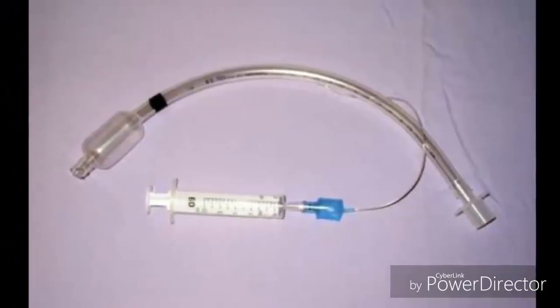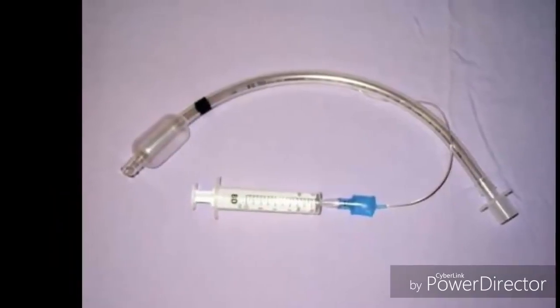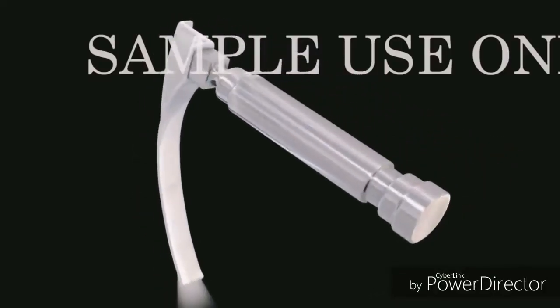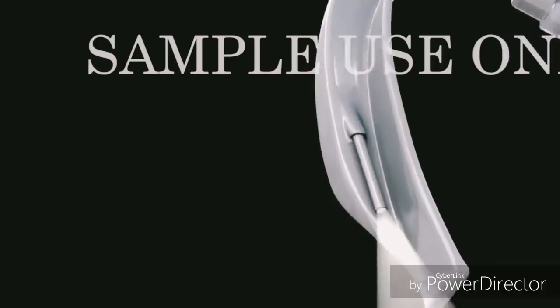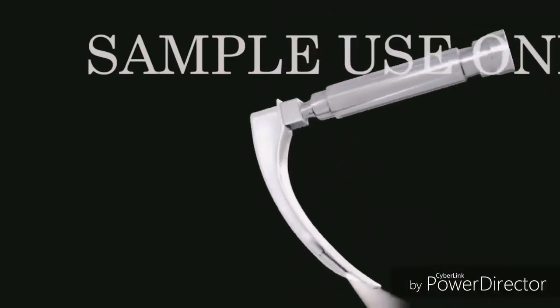To perform the process of intubation, basically two things are required. The first one is an endotracheal tube and the second one is a laryngoscope. The laryngoscope has two parts: the first is the handle of the laryngoscope, and the second is the blade of the laryngoscope with a point source of light. Now we are going to start the process of intubation.